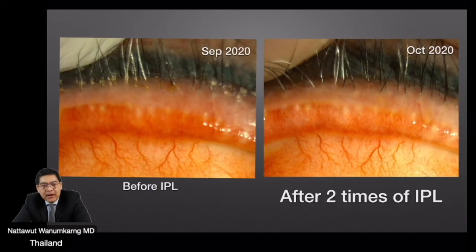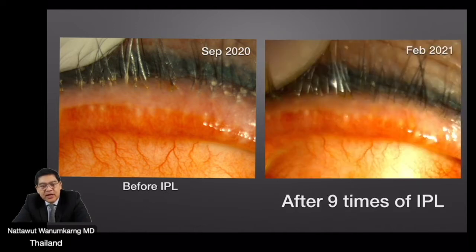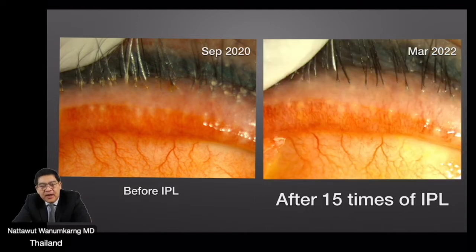This shows my patient before the IPL treatment. They show marked redness of the eyelid margin and a lot of Demodex and bacteria on the eyelashes. After 2 treatments, we can see marked improvement with reduced redness. After 9 IPL treatments, there is more improvement. After 15 treatments, there is marked reduction in the size of the abnormal blood vessels.